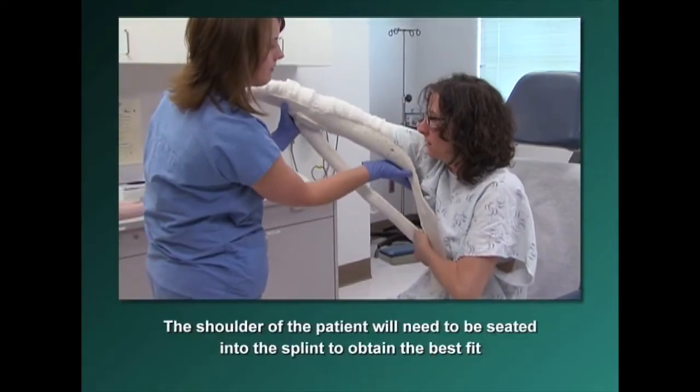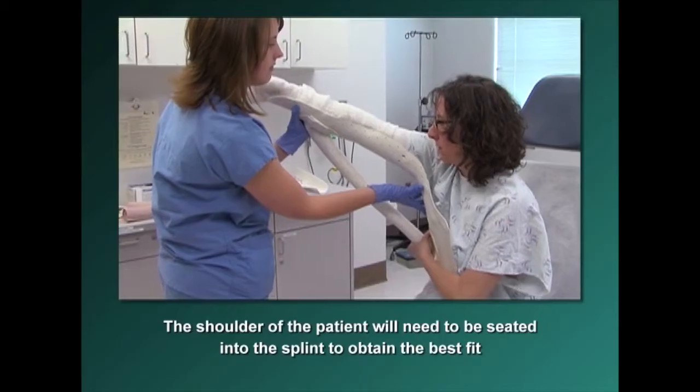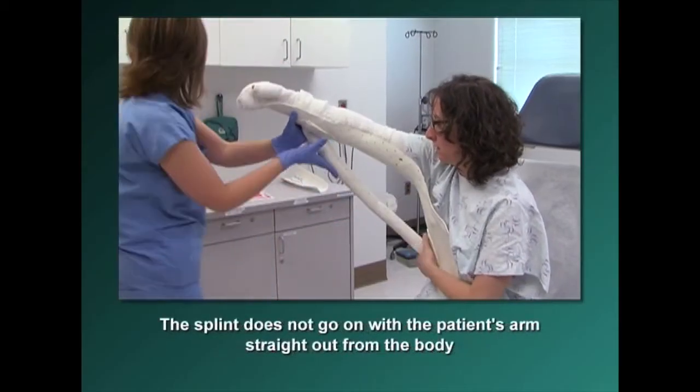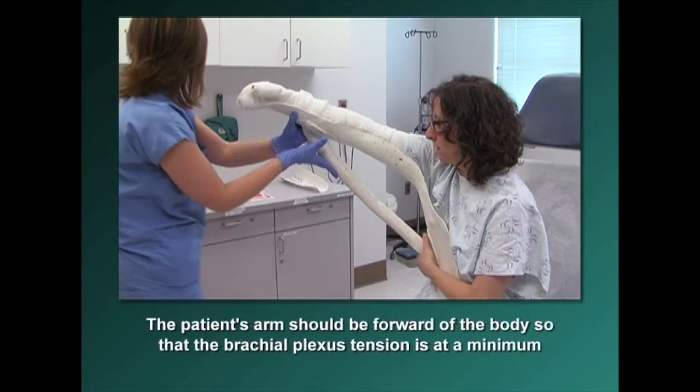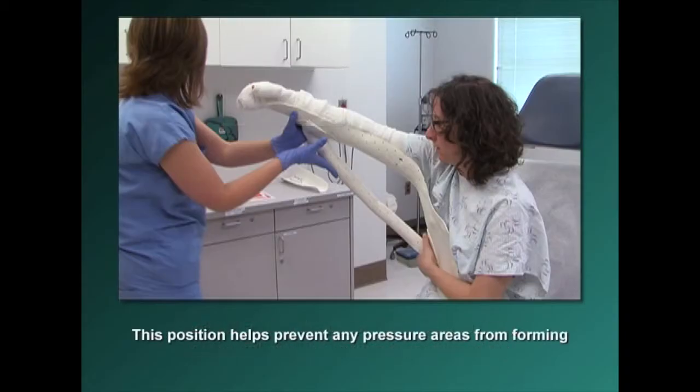The shoulder of the patient will need to be seated into the splint to obtain the best fit. This splint does not go on with the patient's arm straight out from the body. The patient's arm should be forward of the body so that the brachial plexus tension is at a minimum. Place the arm of the patient into the arm trough of the splint with the thumb positioned up. This positioning helps prevent any pressure areas from forming.